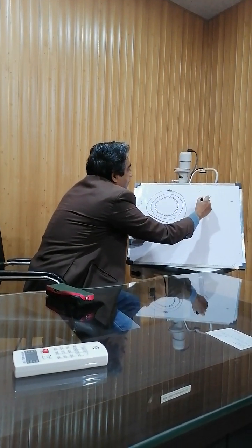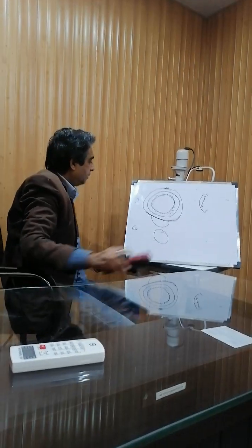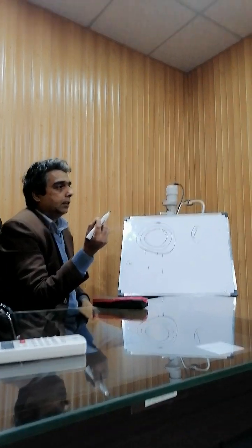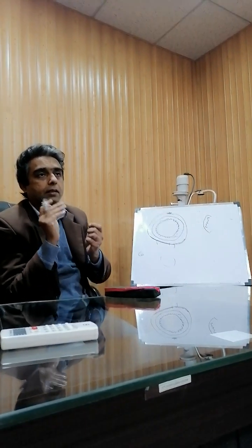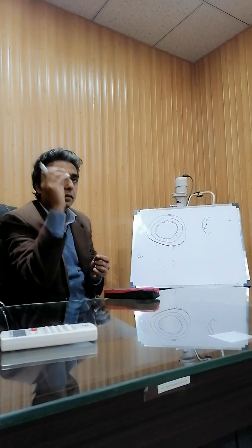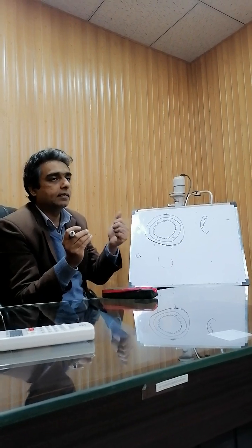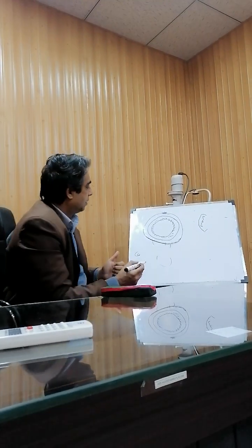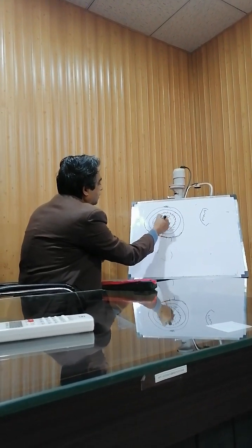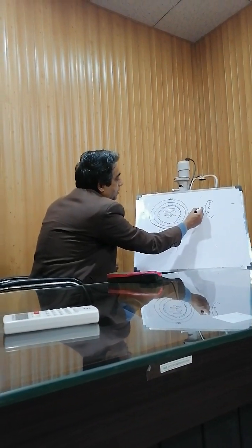Then what are we left with now? The nucleus is removed. We have just the cortex and the posterior capsule. Now, what will we do? By this incision, we have a two-way cannula, of which one part is irrigating, that is normal saline or Ringer, and the other part has a syringe which sucks. With the help of that cannula, this cortex which is left behind, we remove very carefully, not to touch the posterior capsule.